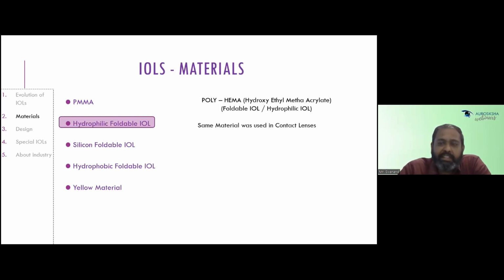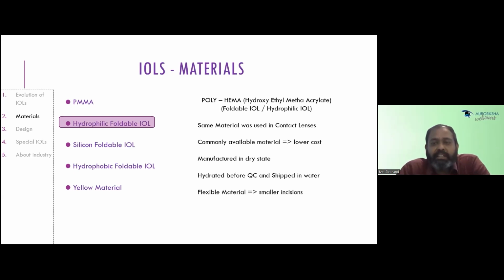And these lenses are called hydrophilic foldable lenses. They are the same materials that are used in contact lenses also. These are commonly available materials, hence they have lower cost. They are manufactured in dry state.